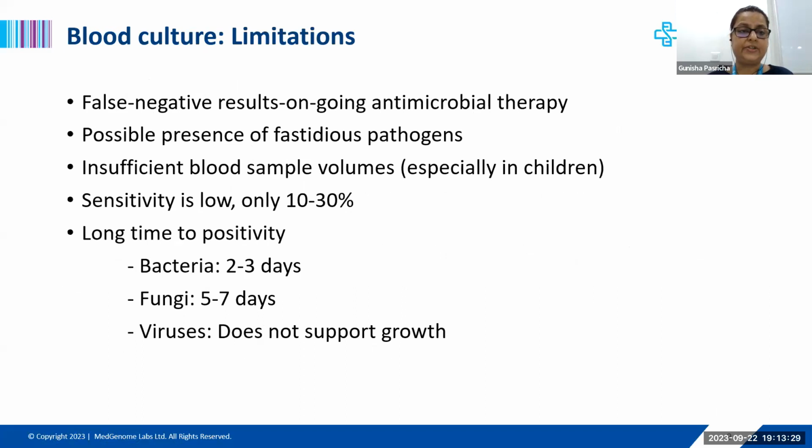Now, what are the limitations of blood cultures? As I mentioned earlier, the sensitivity is 10 to 30%. So there are false negatives. Why are there false negatives? Because there is usually empirical antimicrobial therapy which is already ongoing. There are fastidious pathogens, some anaerobes, and fungi, which do not grow as such. The blood culture does not support the growth of those organisms. And in children or neonates, sometimes the required volume to be put in the blood culture bottles is not there. So these are the reasons because of which the sensitivity is low.